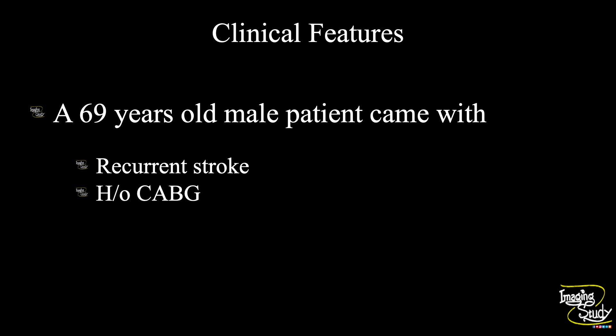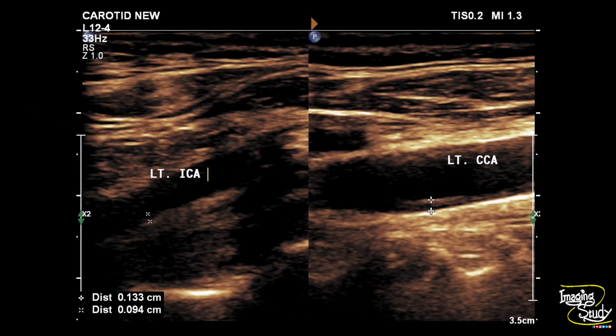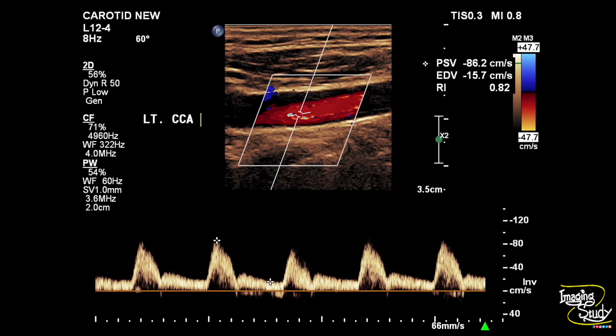Here is the picture of the intima-medial thickness. We have tried to measure from the left internal carotid artery and left common carotid artery. The intima-medial thickness, or IMT, is increased — it is more than 0.8 and 1.0. Now when we check the spectral Doppler, you can see the common carotid artery shows normal blood flow on the left.